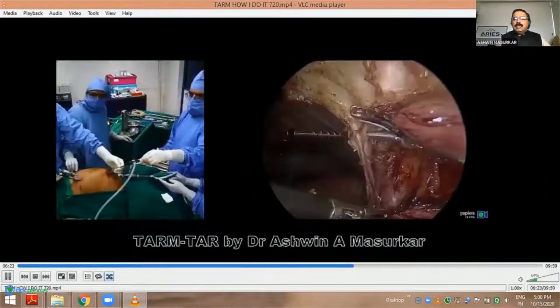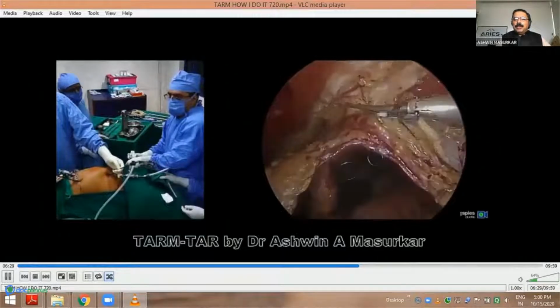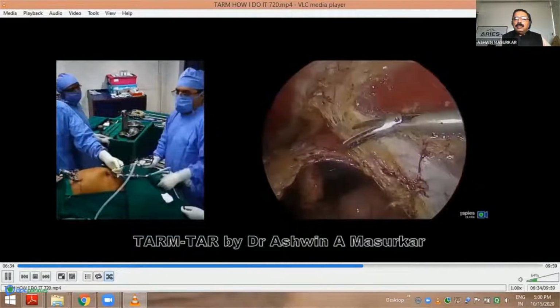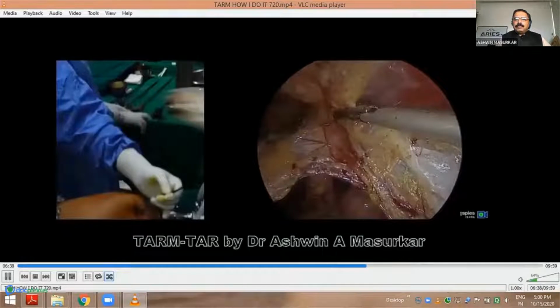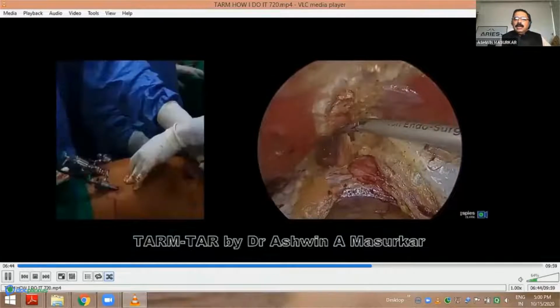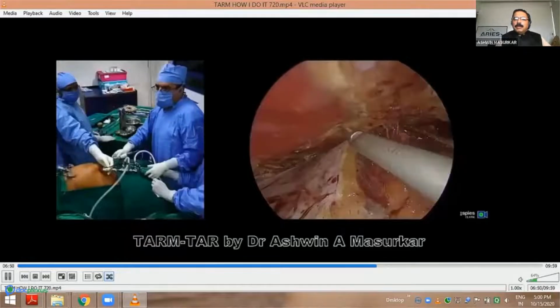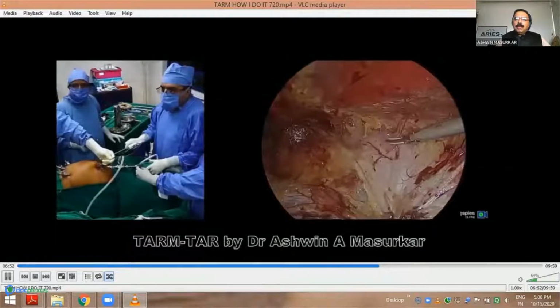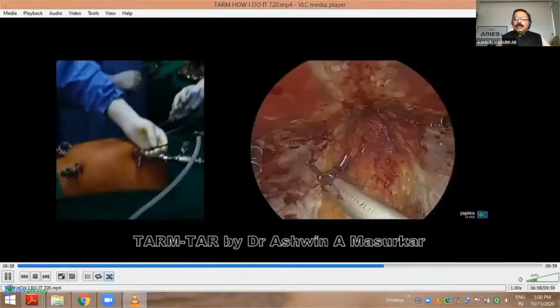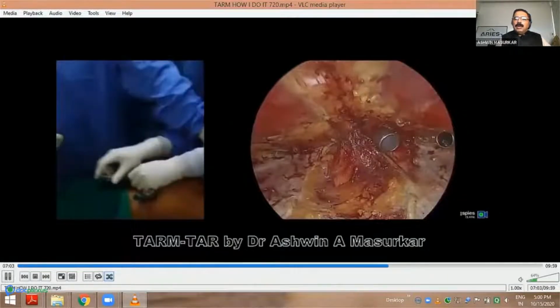You'll have smaller vessels which are supplying from the inferior epigastric or superior epigastric to the PRS, which should be carefully divided. Now that's the crossover fibers from the linea alba attaching to the PRS. And we are now in a retrolinear plane that is also called the fatty triangle, which was described with reference to Rives-Stoppa repair. This is just a replication of the open Rives-Stoppa repair, with a giant reinforcement of the retromuscular space.